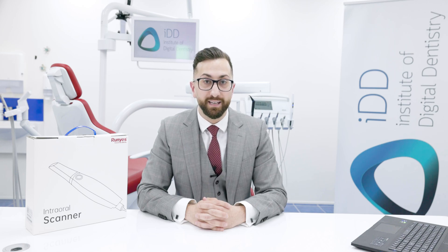This particular scanner is between seven and a half and eight and a half thousand USD depending on the market, making it a very economical offering and one of, if not the cheapest, scanners on the market.